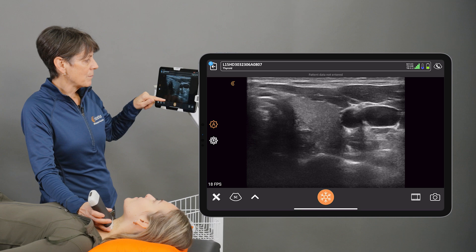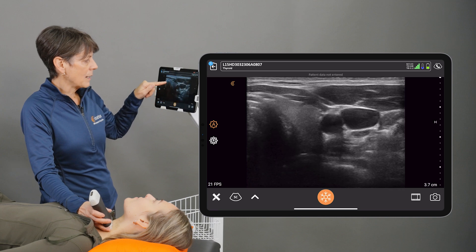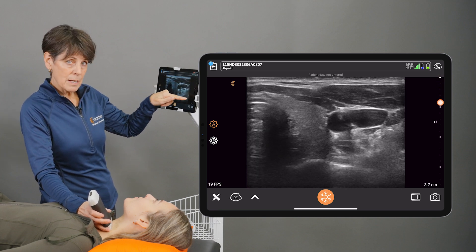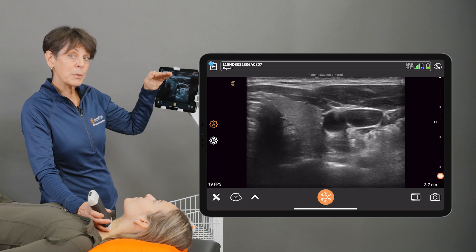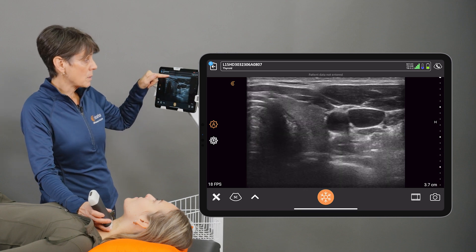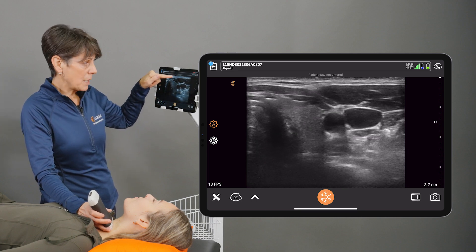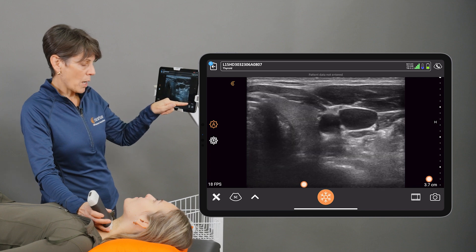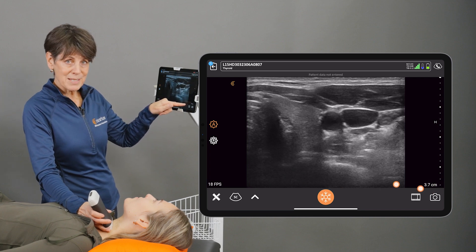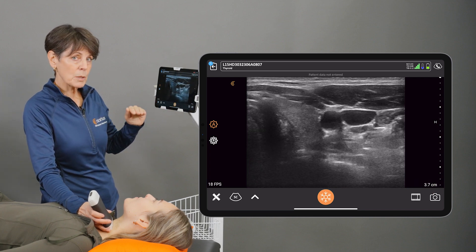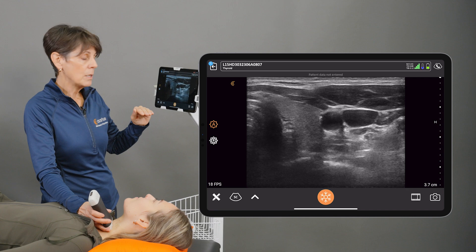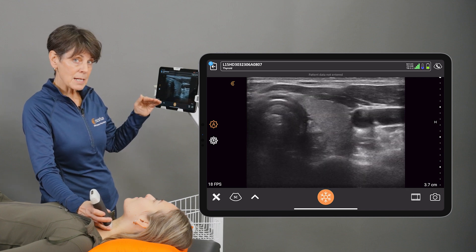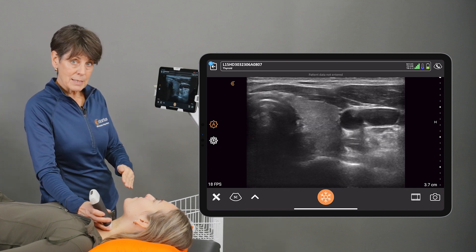We'll see markers down the side of the image that indicate the depth into the tissue. The top of the image is zero centimeters and the very bottom of our image is 3.7 centimeters. Keep that in mind when you're trying to establish what you're seeing directly beneath the scanner.